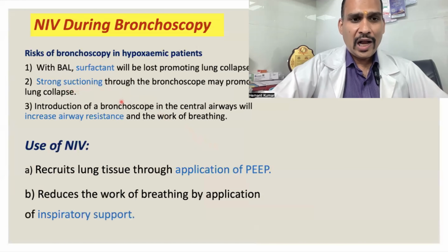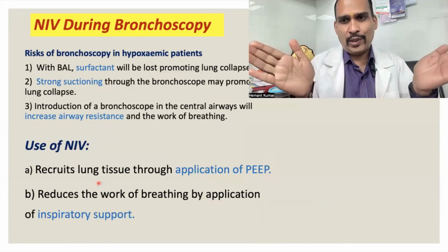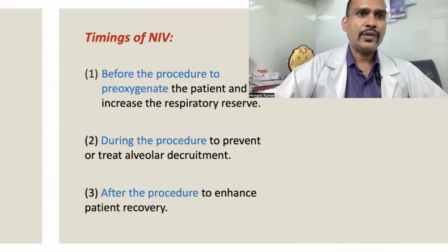So how does NIV help? NIV, by giving PEEP or CPAP, will recruit lung tissue. It will open up collapsed alveoli. It reduces the work of breathing by application of inspiratory support, and it will increase tidal volume.